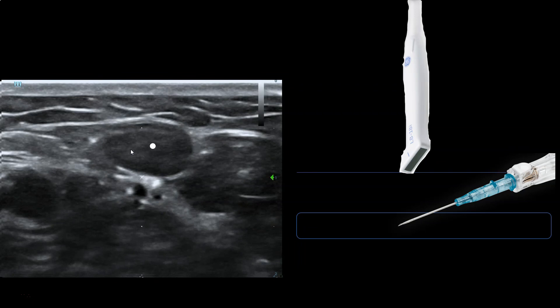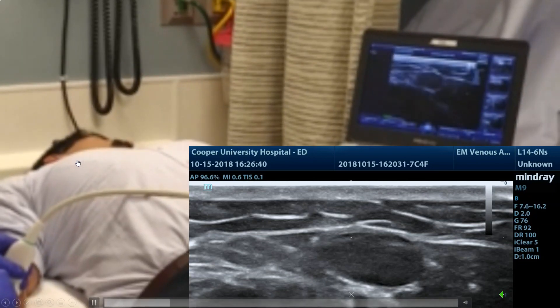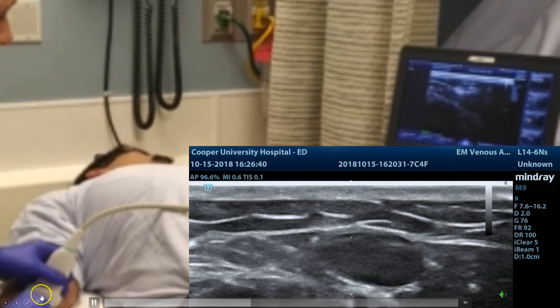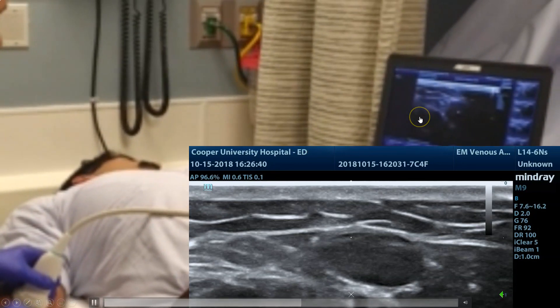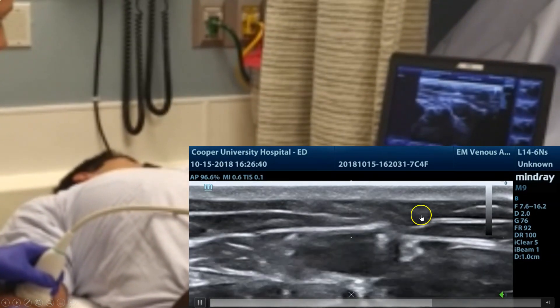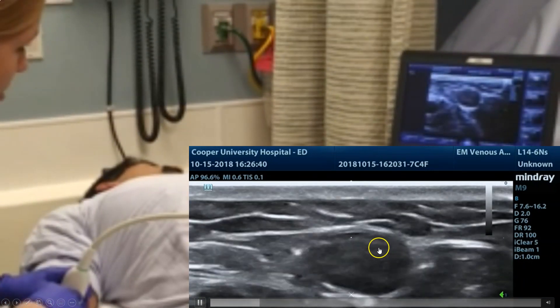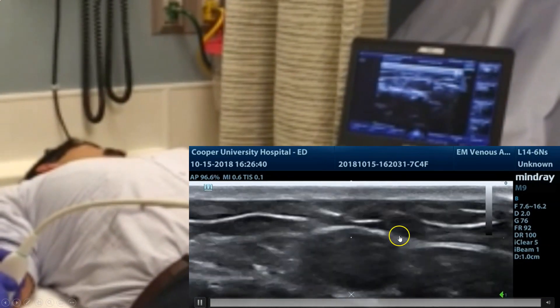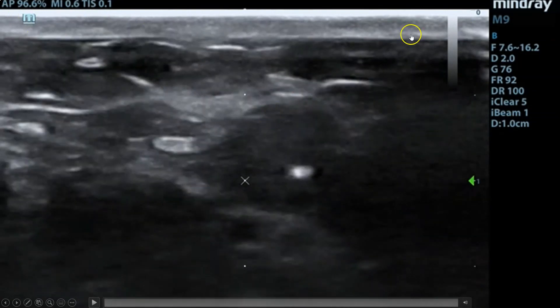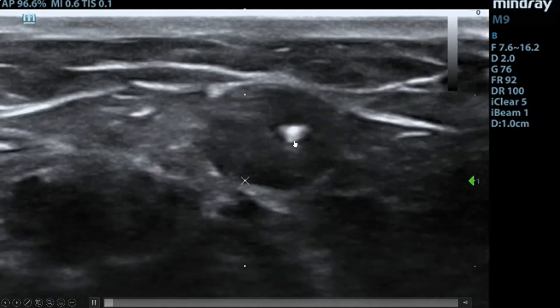Once you've done 50 or 60 of these, we can talk about fancier techniques. Here's a demonstration — a resident placed this IV on me. She's set up nicely with the probe cover, needle in her dominant hand, and probe in her non-dominant hand. The machine is on the other side of the bed. She was a little over-enthusiastic and managed to get most of the way down into the vessel early on. She then stopped and just advanced the needle slowly, then the probe, then the needle, losing sight of the needle tip and catching sight of it again over and over. You can see the needle tip, the vessel, skin and subcutaneous tissue as she loses sight and advances.